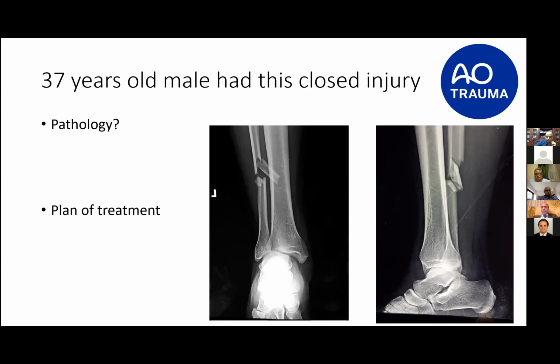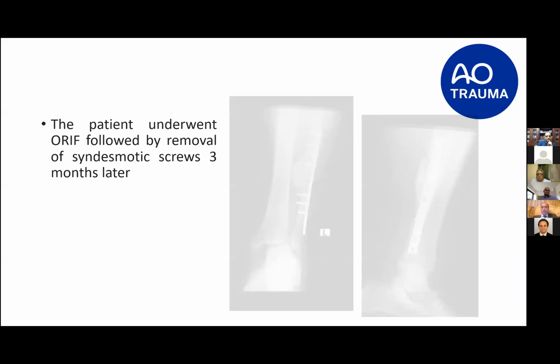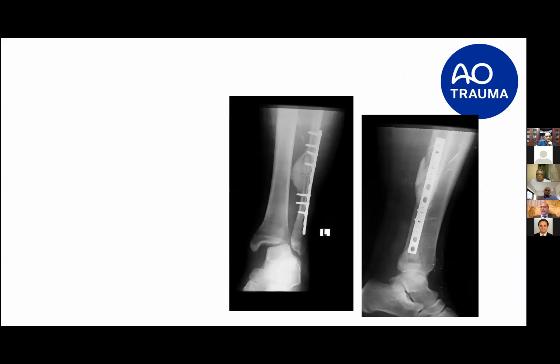Okay, this comes from an expert like Dr. Ossama, but let us see what happened to the patient. The patient underwent an operation for fixation and then removal of syndesmotic screws 3 months later. And this is the plain X-ray 3 months after the first operation.